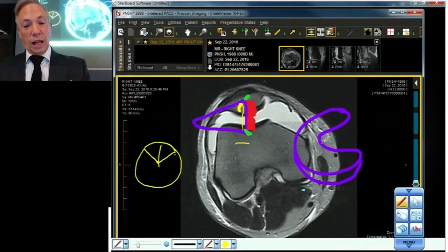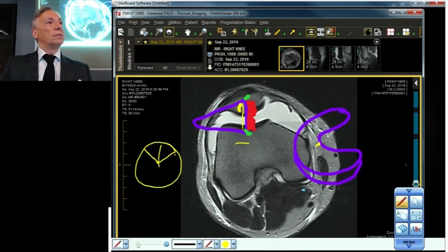So what does that look like? Well, here's the spoke on the wheel right here. It's coming right at you. Sometimes it makes a little V. That's a radial tear. And that goes into the screen. That also goes up and down. It's just in a different axis.